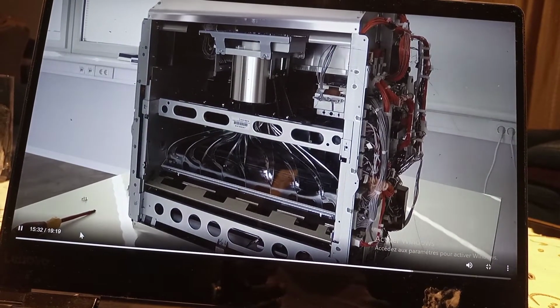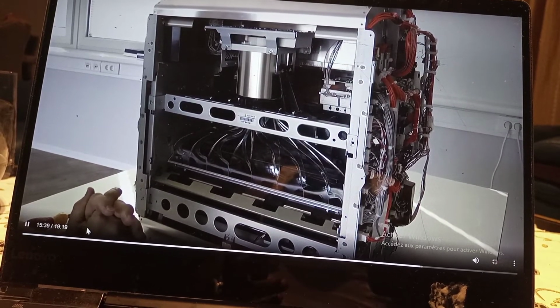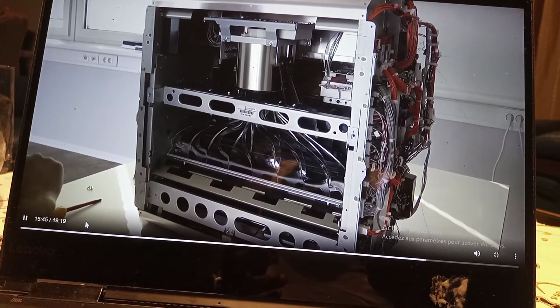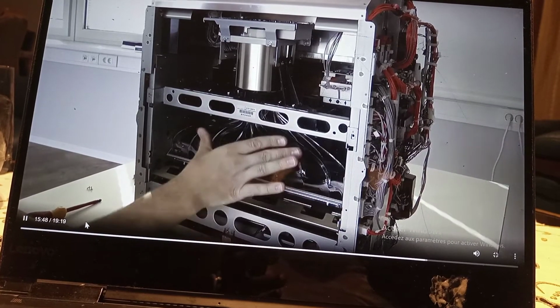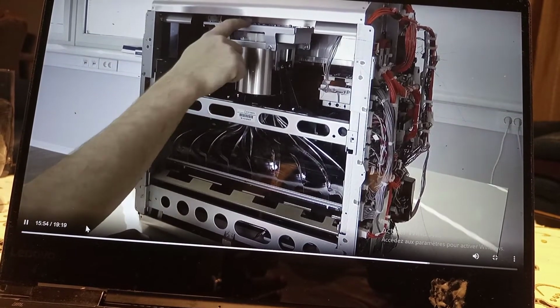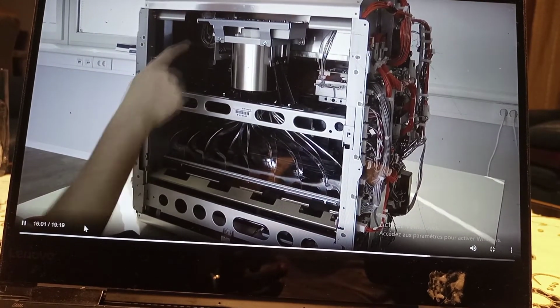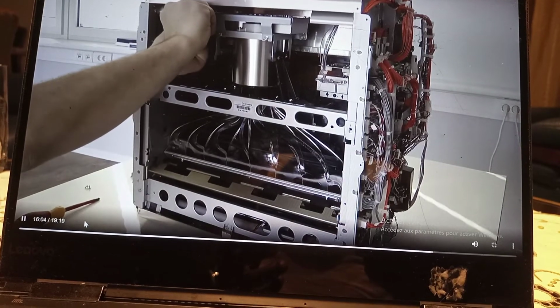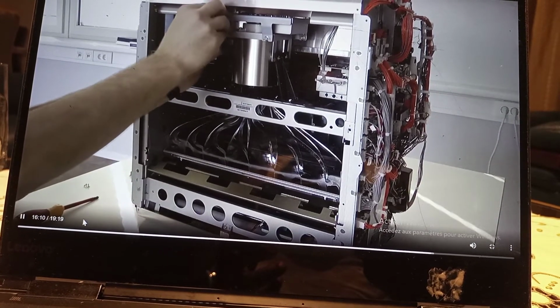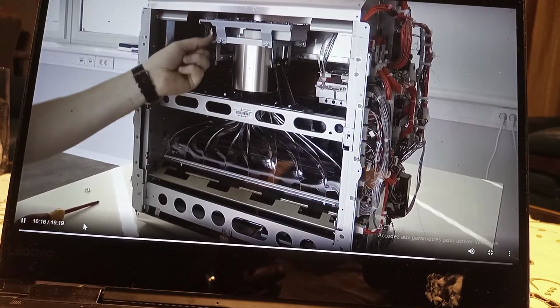So here you can see the light collecting unit. So the laser light, which is sent from the optics unit in the back here and reflected by the image plate, will be collected in this glass unit here and in the sensor on the top here on this board. So to remove this complete unit, first of all, disconnect the connections to the board here. That's one multi-connector, like this, and one coax cable for image transmission. Be careful to plug and unplug it in the right angle.